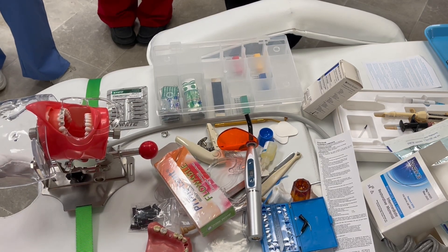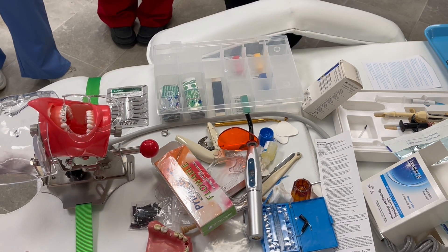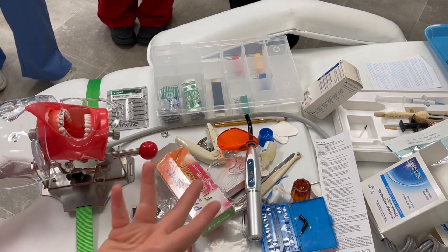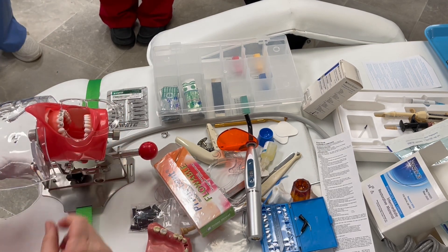Can you mix them to get the right shade? Sometimes, yeah, when you're doing porcelain stuff. So let's say we do a composite filling back here.